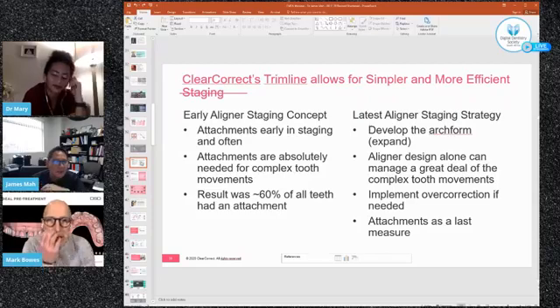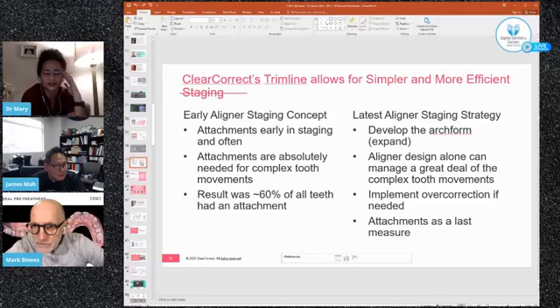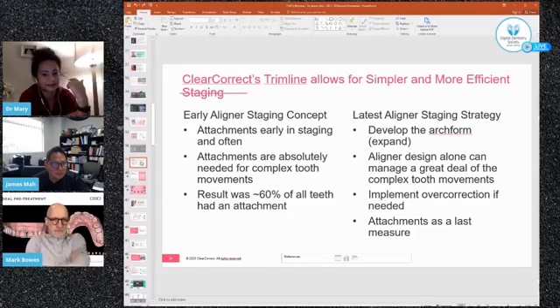Sorry, if I could just add there, I think especially in a South African context as well, we deal with a lot of older patients, so a lot of adults who, realistically, orthodontics and fixed braces as a teenager, the usual age when therapies like that are carried out, were just not an option based on our demographic and based on our history. So now we're able to offer them a solution to prevent further malocclusion, to prevent the situation from going worse. And they're more keen to accept it because it doesn't mean that they're walking around with fixed braces on their teeth that's going to impact them in their professional lives. So there is a good case acceptance when it comes to adults and clear aligner therapy.